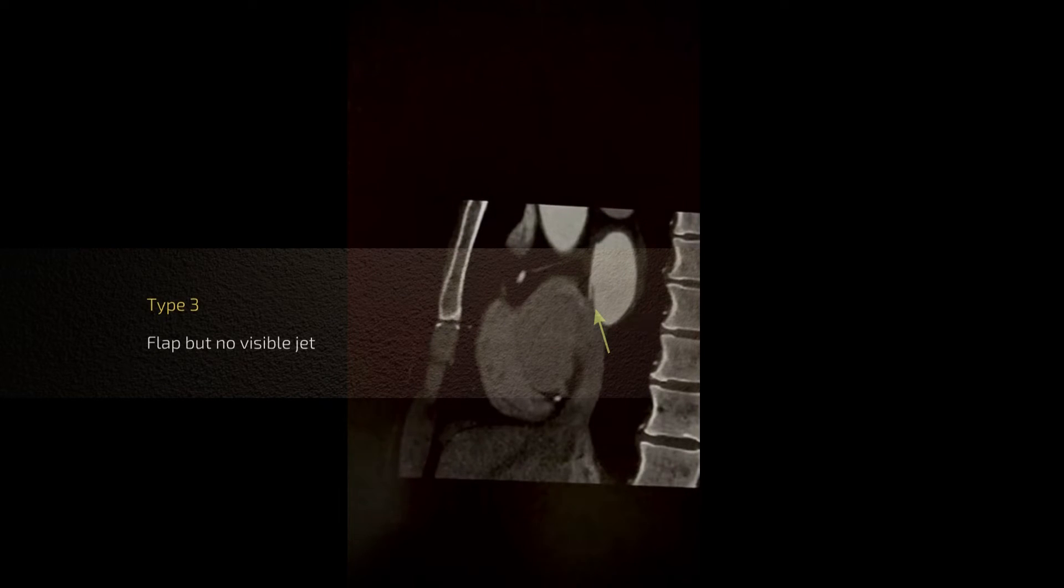It's sometimes better evaluated on the sagittal images so we're going to have a closer look on the sagittal image where you can clearly see this flap-like appearance here and which appears contiguous to the next chamber.